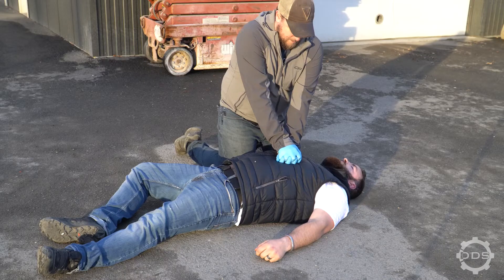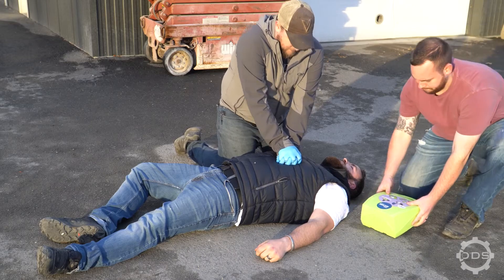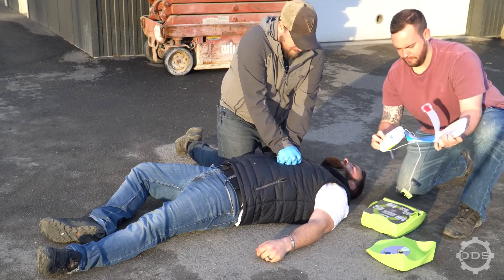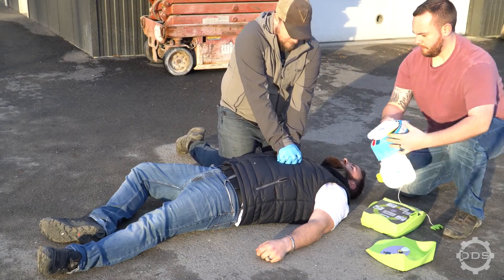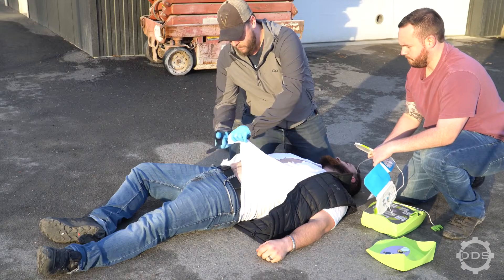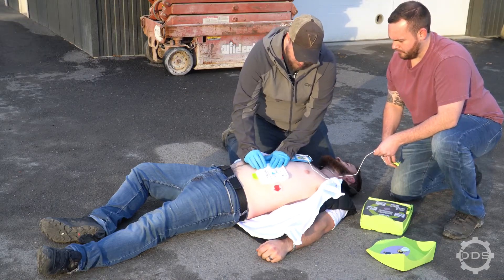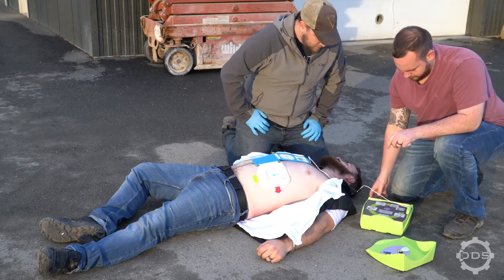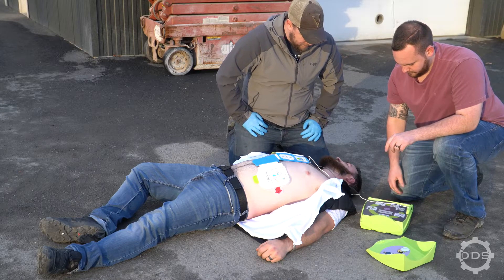Now let's talk about the use of an automated external defibrillator, or AED. An AED is going to greatly increase the chances of survival of someone suffering from cardiac arrest. Continue CPR even after the AED arrives. Have the person that brought the AED prep it by opening it up and turning it on. Ensure the patient is not lying in water, expose the bare chest, attach AED pads per instructions, and be sure the patient has no metal jewelry like necklaces or chains.